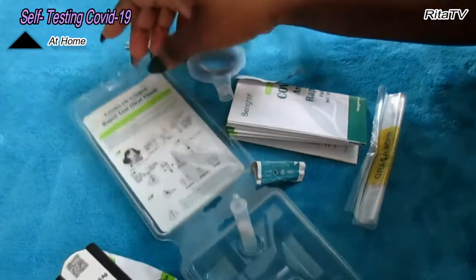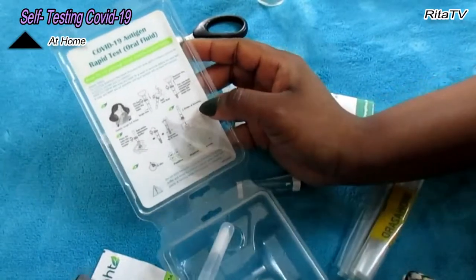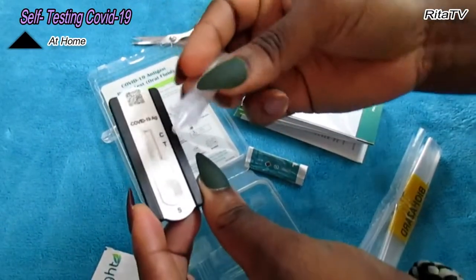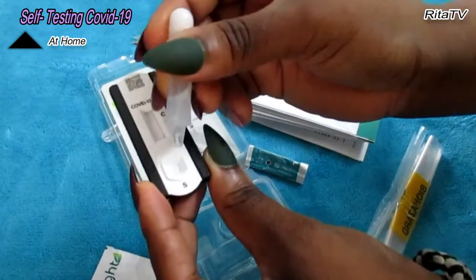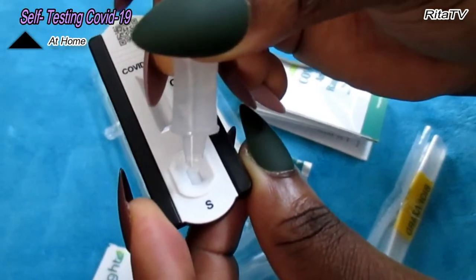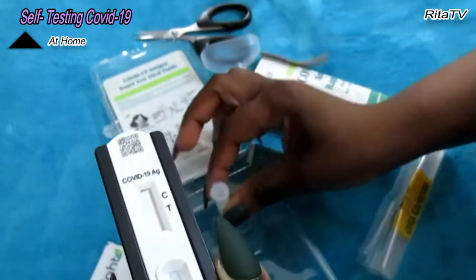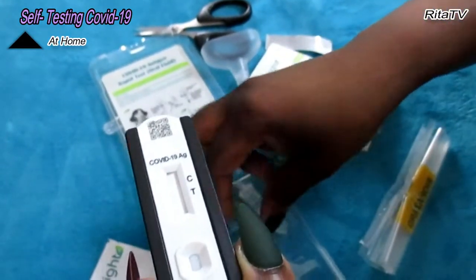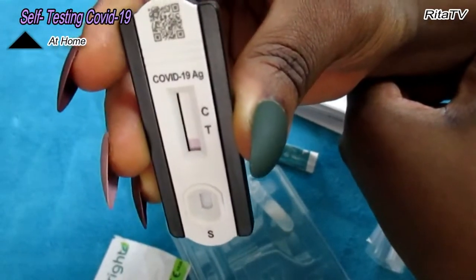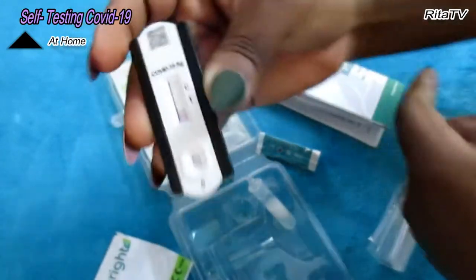So let's read it. Drop 2 drops of solution into this place. We are going to add just 2 drops inside this place. So let's go. One, 2. So that is it. As you guys can see now, it is already reading. So I'll see you when the result is out.